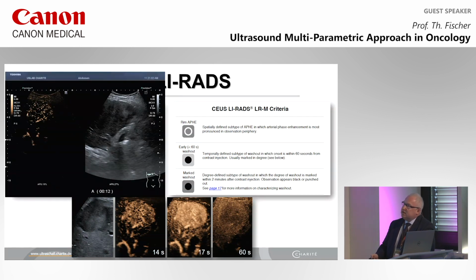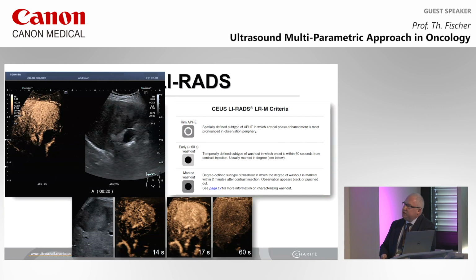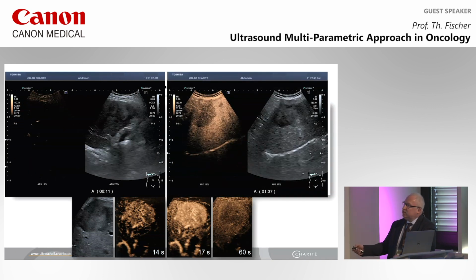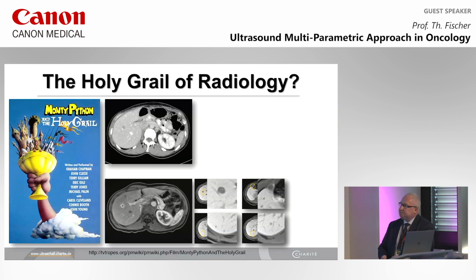This is how it looks like in real-time, split screen mode, early inflow, highly vascularized, very well depicted with your system, so that you have a full and clear view on the lesion itself. And last but not least, you can see here 1 minute 37 seconds. We have this clear washout of the lesion, which is very important to define a malignant one. And in that particular case, this should be an HCC after the staging procedure or after the LI-RADS classification.